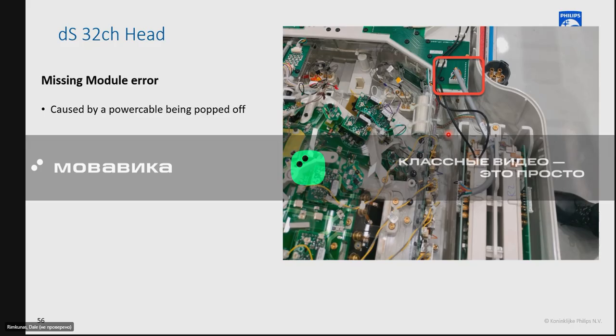Sometimes you need the documentation to find something specific. If you know channel 10 is bad, you can find in the documentation where channel 10 is on the 32 channel head coil. But a lot of times, just open it and you can see something obvious.